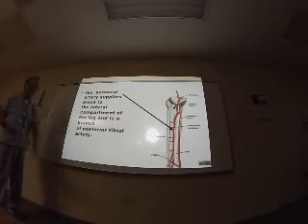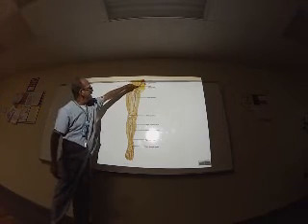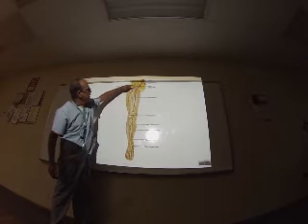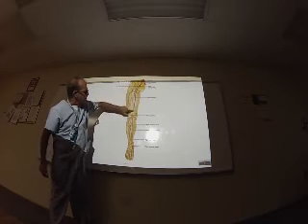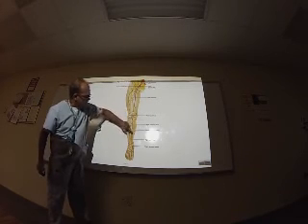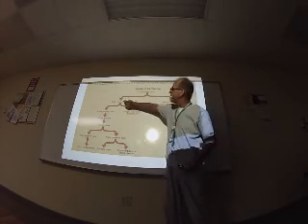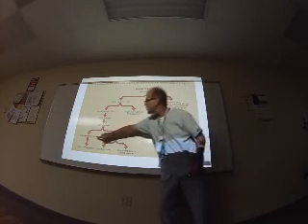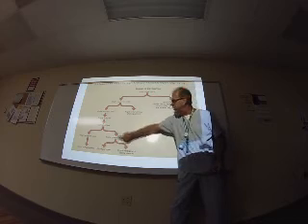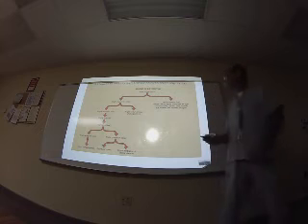They don't scan the peroneal artery in general, very little. You can see the picture: external iliac, common femoral, femoral artery. I cannot see here the deep, I suppose this is the deep. Popliteal, posterior tibial and anterior tibial. And this is the same that you remember: aorta, common iliac, external, right femoral, right popliteal, bifurcation, anterior tibial, bifurcation in right peroneal and the lateral.